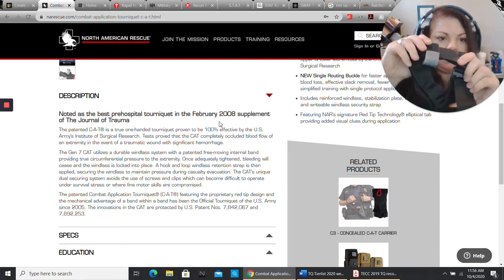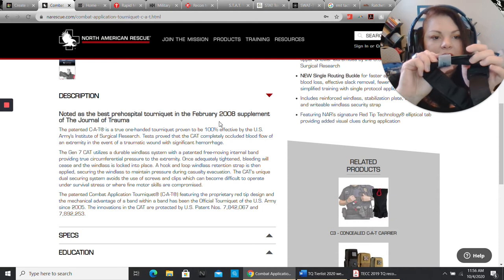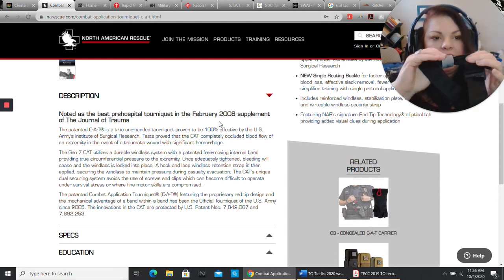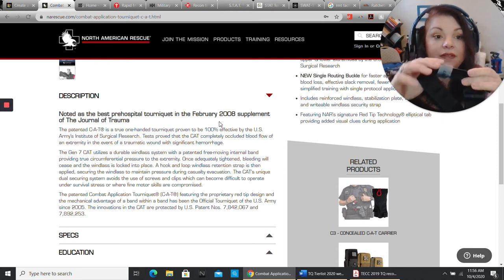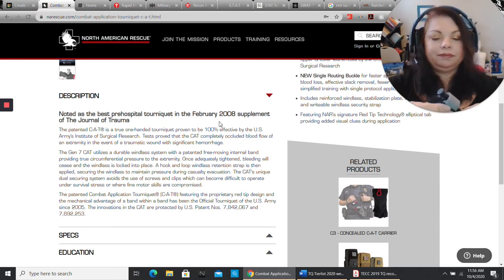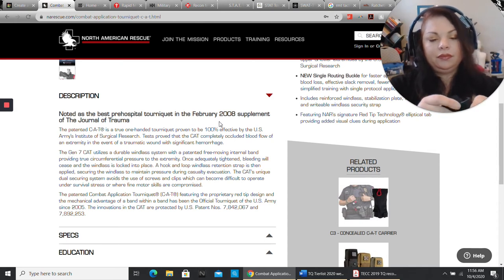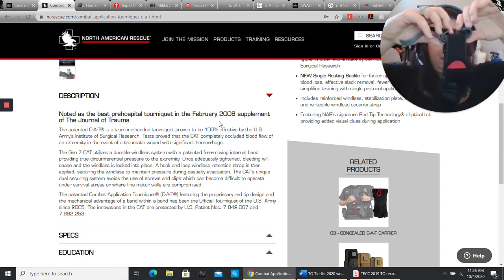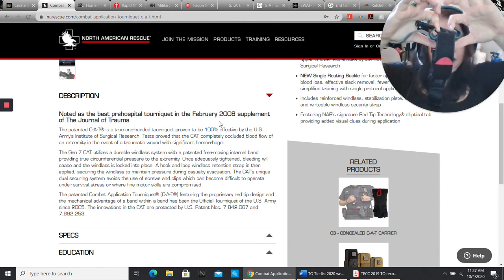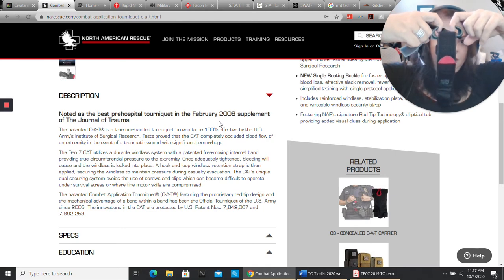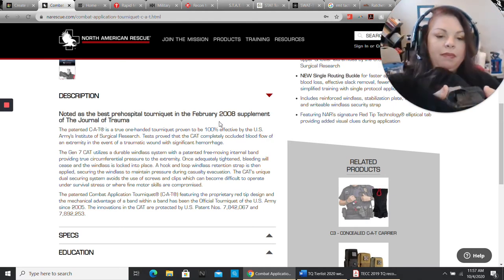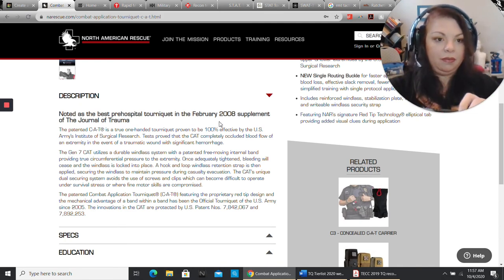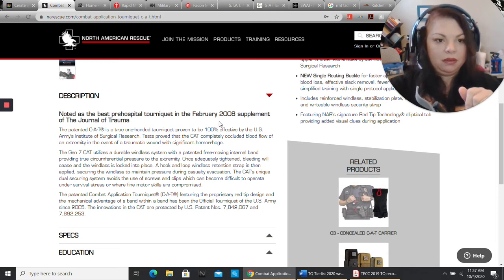And I'll show you why I don't. This could be just my own quirk. But some of the weak points of tourniquets, particularly like this, is this back piece. So this back piece is plastic. And something that really annoys me is when it's a very thin little piece of plastic, and I can twist it a lot. They've gotten better, to be fair. But here's the other thing. I don't like that the windlass clasp that's on here is so easy to bend out like this. I am just using my two fingers and I'm able to pull it that far out. And I'd be willing to bet that I could probably snap it.